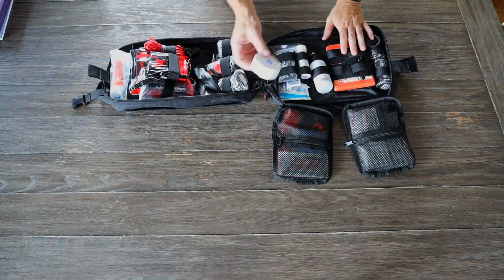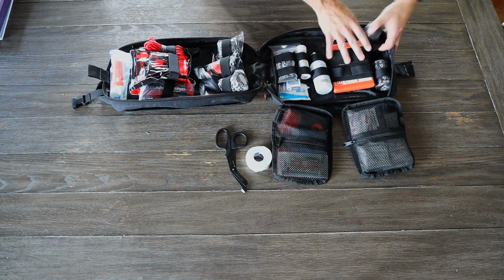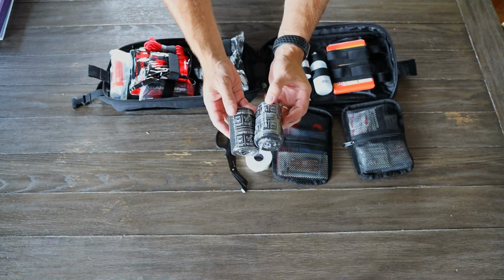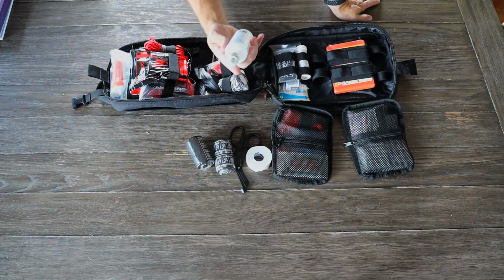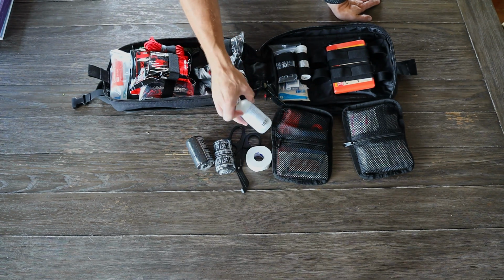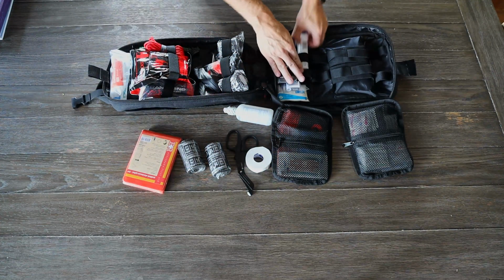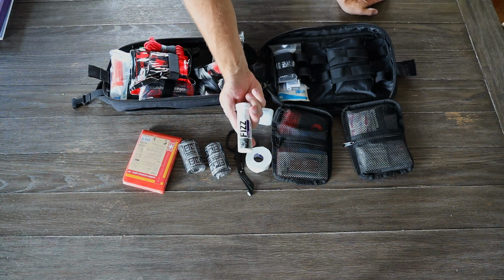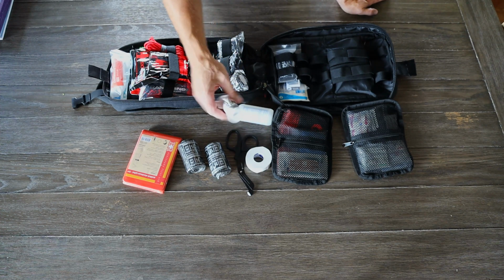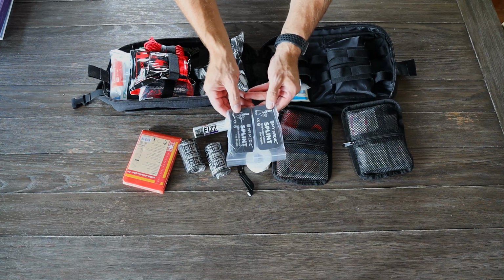tape, good size roll of that. Your shears. You've got 2 compression bandages. Right here we have 4 ounces of sterile fluid, great for rinsing wounds, similar uses to that. We've got splint material here, setting up a splint. Electrolyte tablets. These are something pretty similar to like a Nuun tablet or something like that. If somebody's dehydrated and you think there's an issue with electrolytes, you can have them use that. We've got a couple smaller splints for fingers.